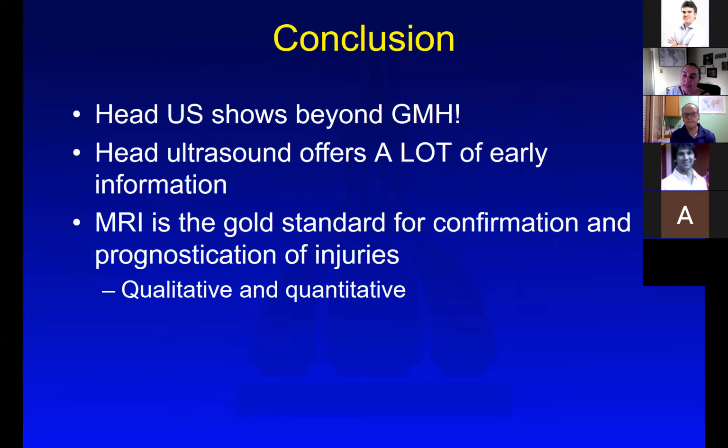We do that. I am hoping that this lecture may inspire more use of ultrasound because, to my knowledge, in Brazil, the radiologist performs the ultrasound, correct? Yeah, I think that's a huge advantage because you know what you're expecting to see, so you can really tailor your protocol accordingly.